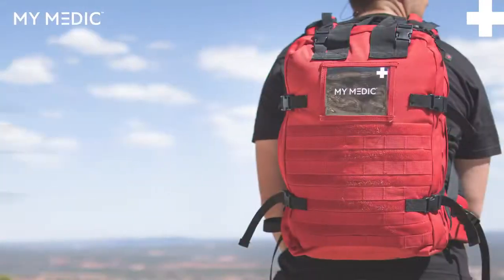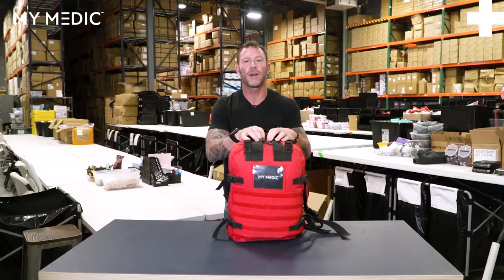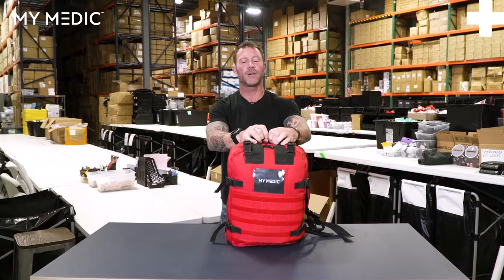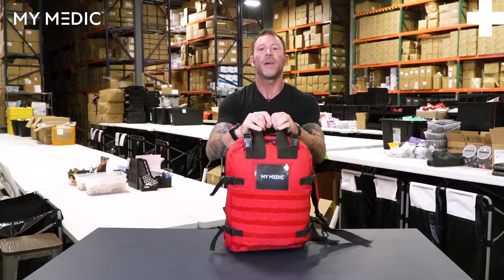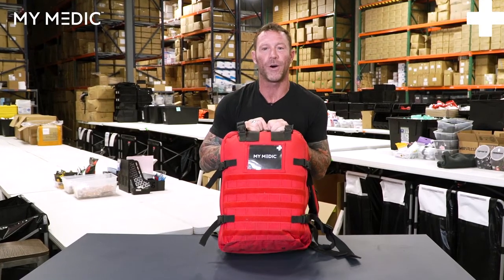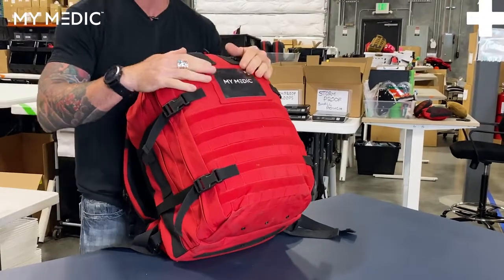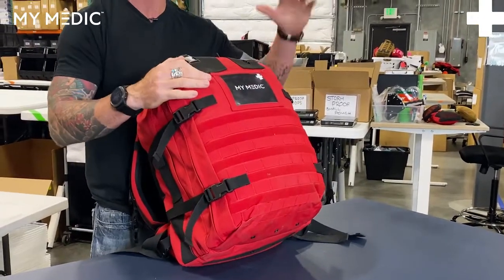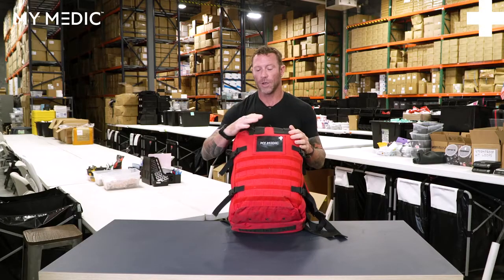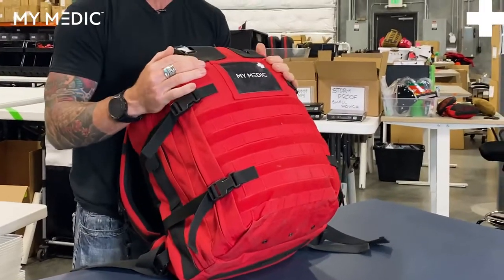Hey y'all, Billy Haley here, Director of Education at MyMedic, and we are checking out The Medic today. This is the biggest bag that we sell. It is chock full of 550 first aid items — and I'm not talking about the box store 200-item first aid kit which is all band-aids. This has all kinds of stuff in it to treat several patients for all types of injuries, from massive traumatic injuries all the way down to minor injuries. This kit has it all, and it has a bunch of it.